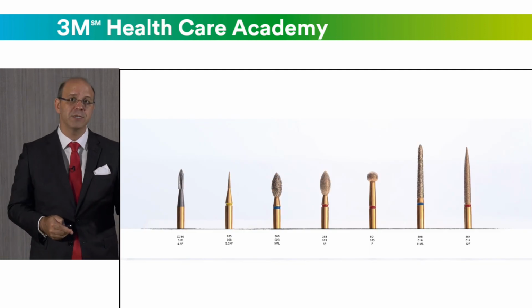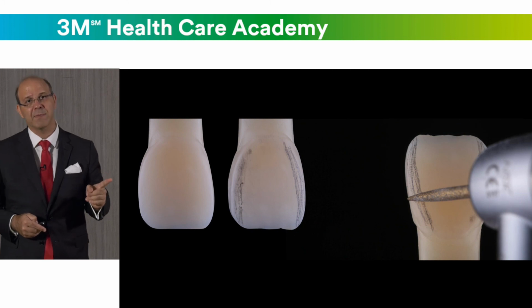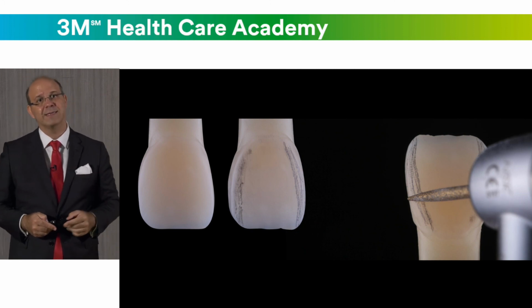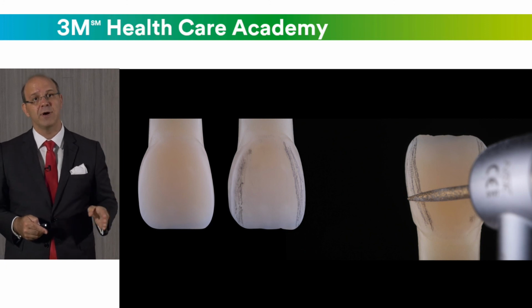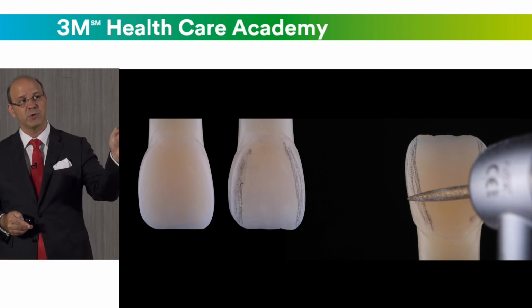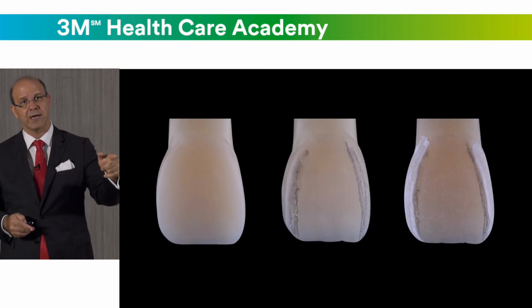So you can use burs and rubbers to make these steps. The first step about the shape is to correct the angle lines. You can pick up a medium fine grain bur, hold it at 45 degrees to the tooth surface, and pass until you touch the angle lines.